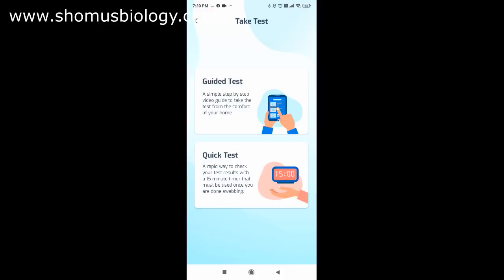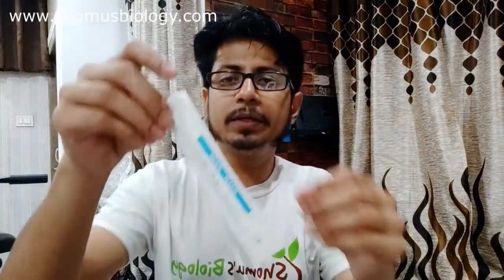I'll take the nasal swab sample first and then start the timer. Open the swab packaging carefully — make sure you open it from the non-brush side and never touch the brush side. For the nasal sample, insert the swab at a slant angle and rotate it three to four times, then insert it into the other nostril and do the same to get enough sample.